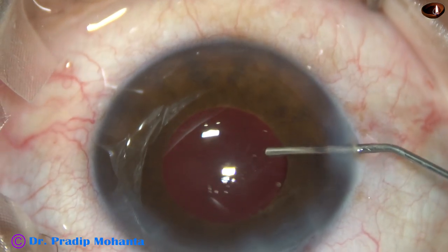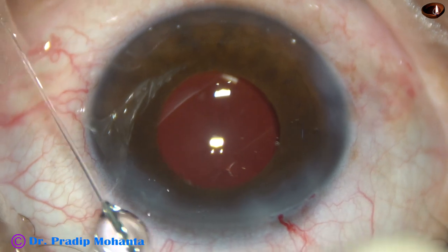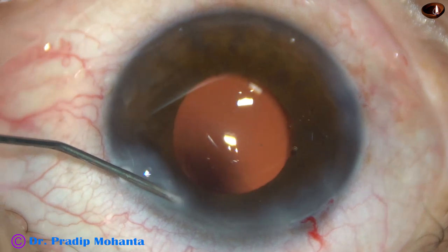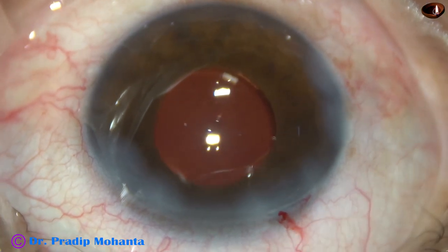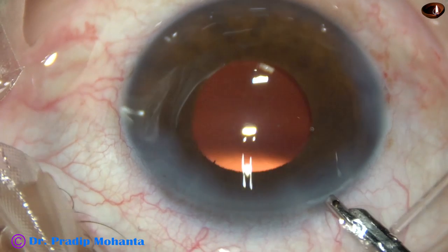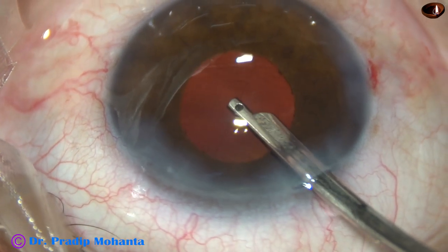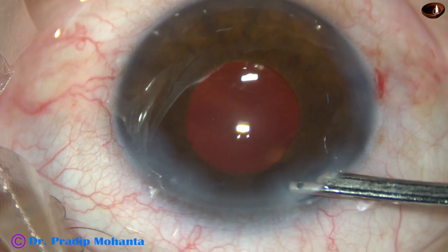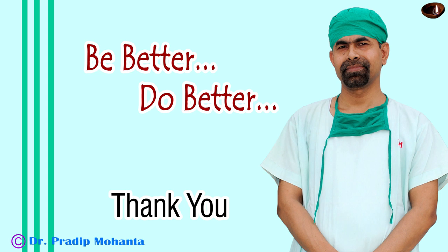Now this is a bit of moxifloxacin. The side ports are closed by corneal stromal hydration — BSS is injected into the stroma towards the limbal side of the side ports; in this way you can decrease the incidence of Descemet's membrane detachment. This is the final lavage of the anterior chamber. I do this in all cases and I believe that this decreases incidence of endophthalmitis. Thank you very much for your attention. I hope this video will help you in developing your surgical skills. Be a great surgeon and serve mankind with love, respect, empathy, and great surgical competence.